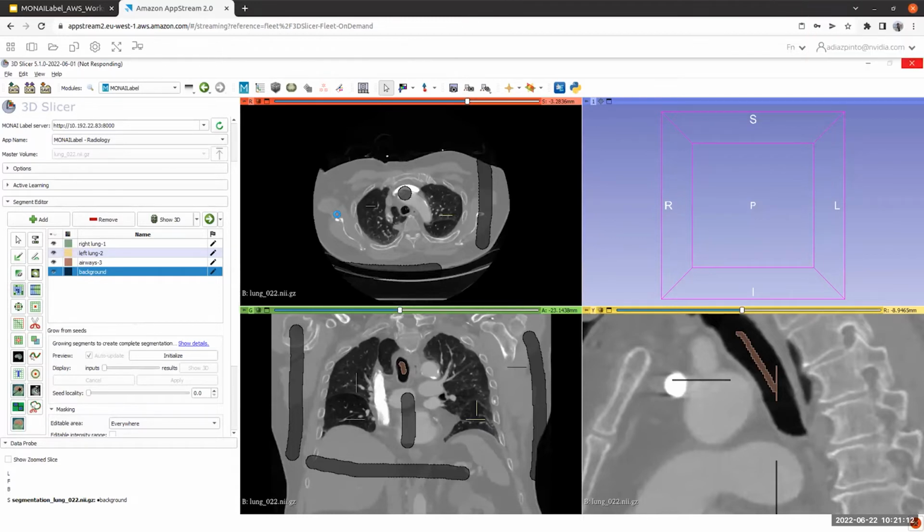Yes, definitely. This is Qing. Most of the servers are up and running. We do have a number of servers that are still downloading the large data set. So when you can't connect to the MONAI Label server, please let us know in the chat your email address so we can check which server is assigned to you and make sure it's running. Or if it's still starting up, we will also be able to find another unused server and assign it to you to get you started.